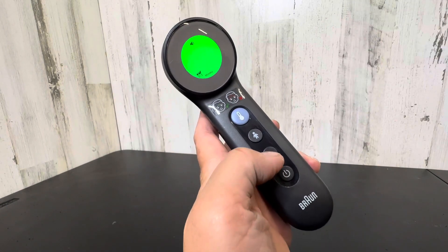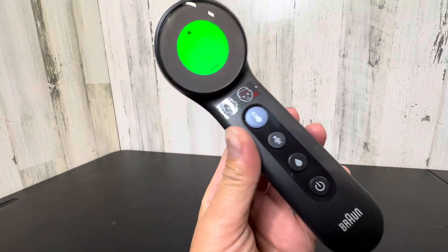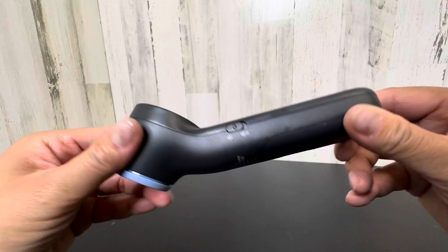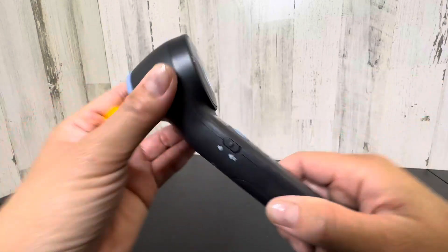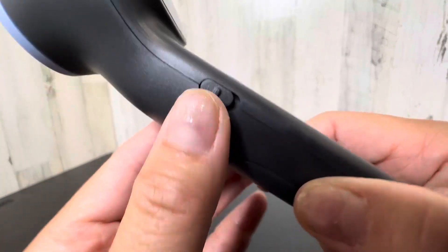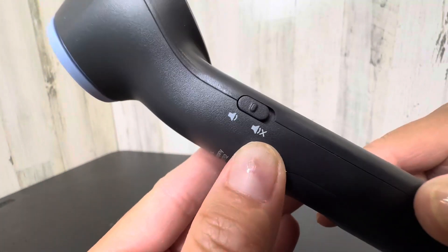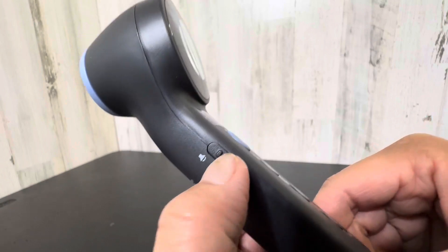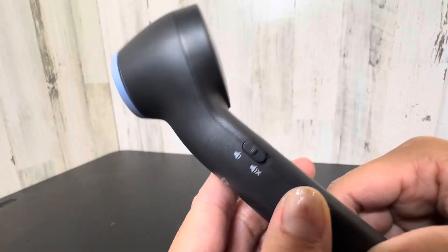It's not going to do it right now because I'm not pointing it on my forehead — you're supposed to point it on your forehead. But I love how simple it is and it feels fairly solid in my hand. You can have a louder sound or a more quieter beeping sound.